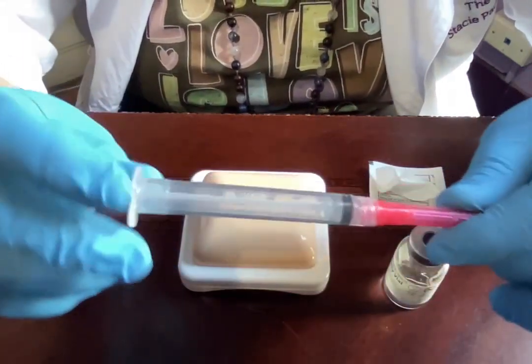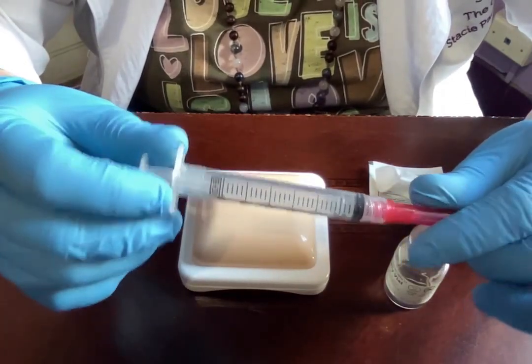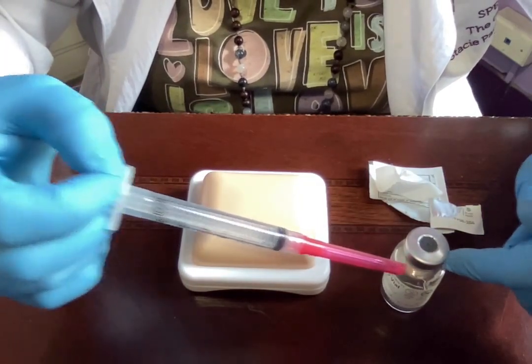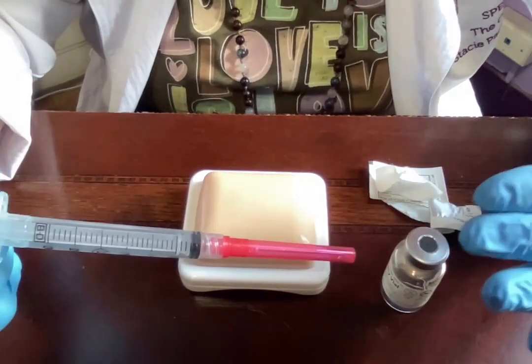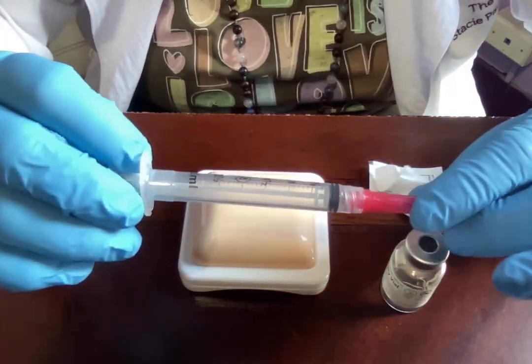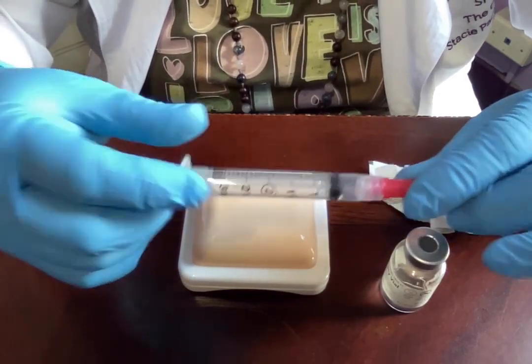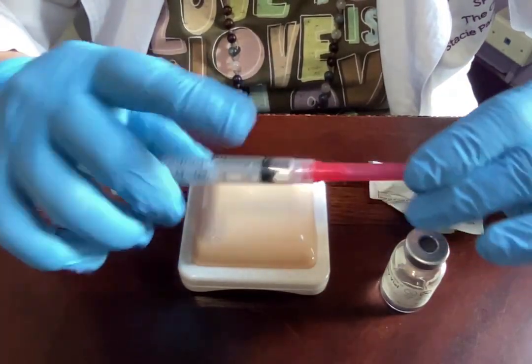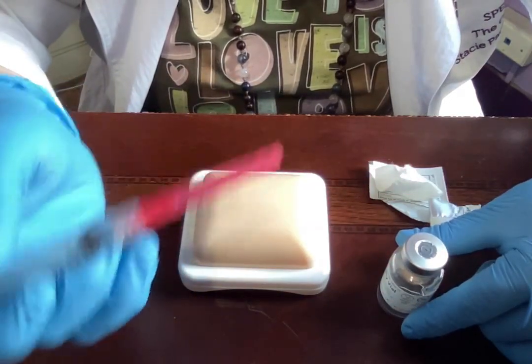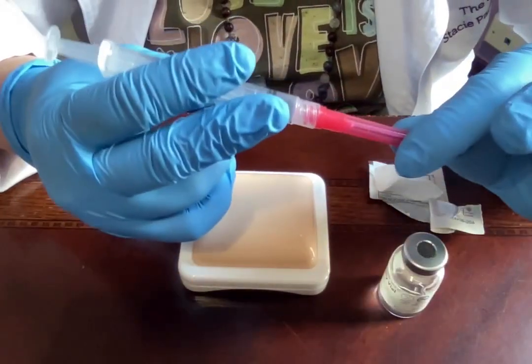The next step is to pull up an amount of air equal to the dose you'll be drawing from the vial. The reason is that a vacuum is created inside the vial, and if you only pull liquid out, that vacuum will eventually cause leaking or spraying. For our purposes, the dose is 0.5 milliliters, so I'll draw up 0.5 mL of air, which I'll then inject into the vial before drawing out 0.5 mL of liquid.